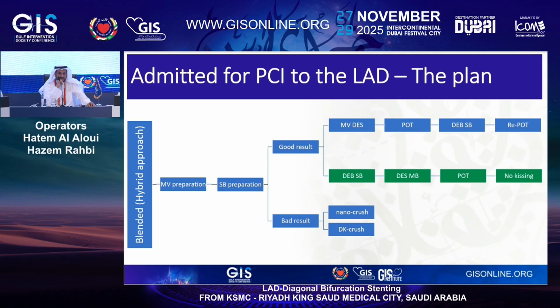And Dr. Hazem can show us the findings on the IVUS. Go ahead, Hazem. Yeah, hi, good morning. I think you can all probably see the screen. So this is the Avigo Plus IVUS system.